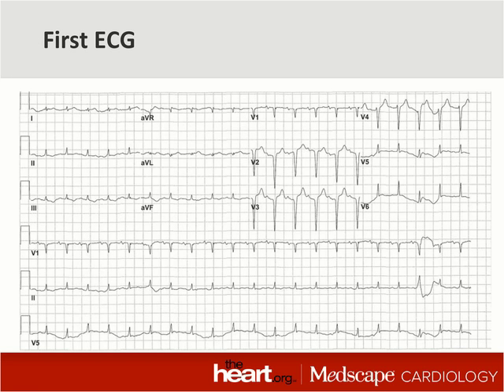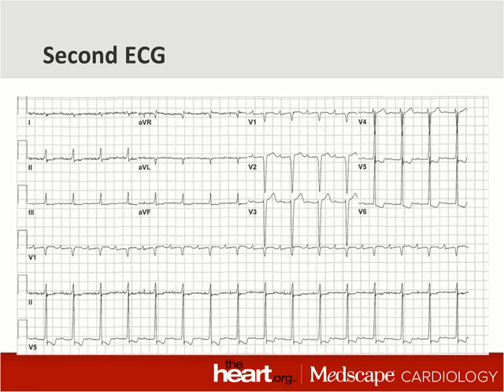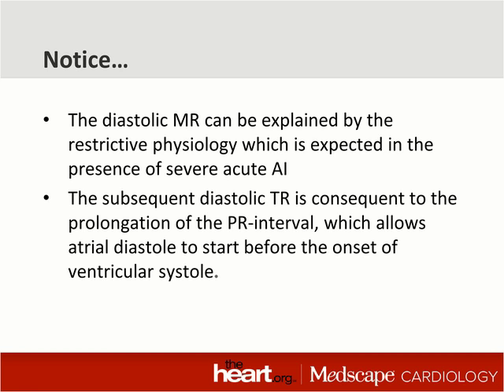Let's take a look at the first electrocardiogram. Notice that the PR interval is normal — probably in the vicinity of about 160 to 180 milliseconds. Contrast that with the second electrocardiogram, where the PR interval is approaching 280 milliseconds — much longer. The diastolic tricuspid regurgitation is not consequent to the aortic endocarditis per se, because the aortic regurgitation doesn't increase the filling pressures on the right ventricle, only on the left ventricle. However, because the PR interval has prolonged, we now allow the presence of atrial diastole to occur before the onset of ventricular systole, allowing the driving force of tricuspid regurgitation to start in diastole because ventricular systole is delayed.